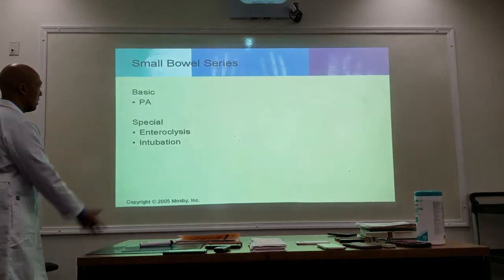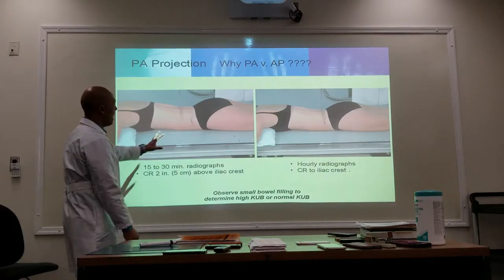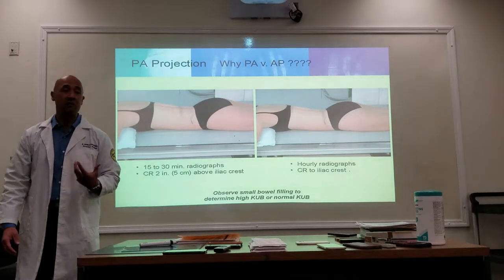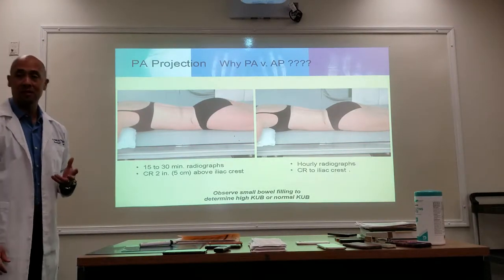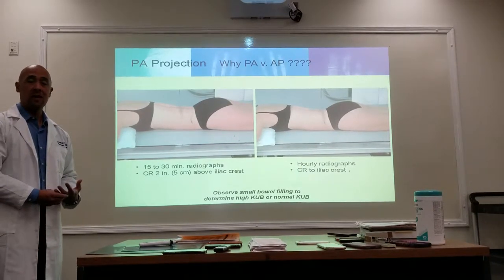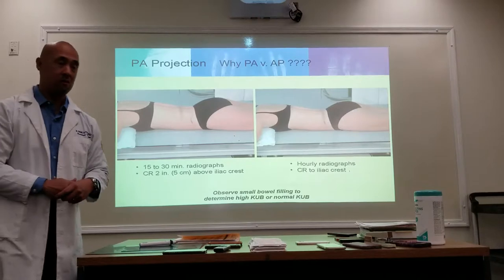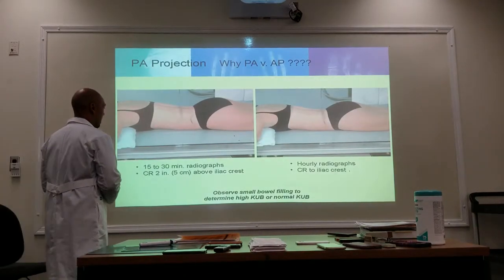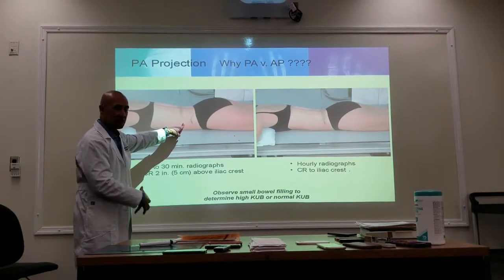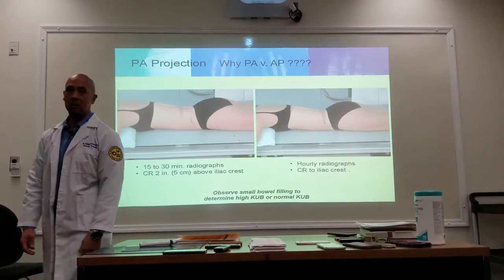All right. So all these KUBs, they're done PA, okay? So again, high if the contrast is still high. So these are not set rules, okay? Look for the location of the barium, but at least for the first couple of shots, it's highly likely that the entire bowel is going to fill up, so just do high KUBs. Then look at your images, and if it's moving, then adjust your KUBs accordingly, okay? So high KUBs is about 1.5 to 2 inches above the crest. If it starts to fill out the distal segments of the small bowel, then start doing your regular KUBs. Prone, again, prone, okay?